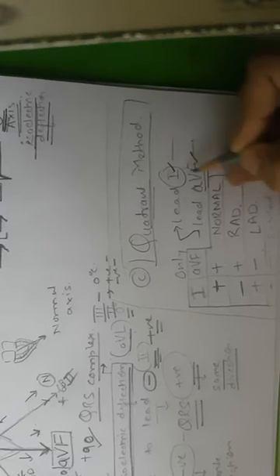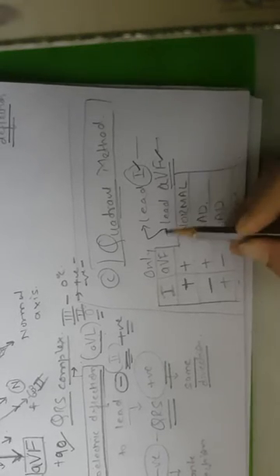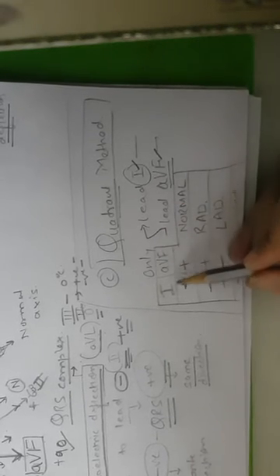In the quadrant method, you just see lead 1 and AVF, and these are the criteria for normal, right axis deviation, left axis deviation and extreme deviation. You just see the QRS complex in lead 1 and AVF. So these are the two methods.